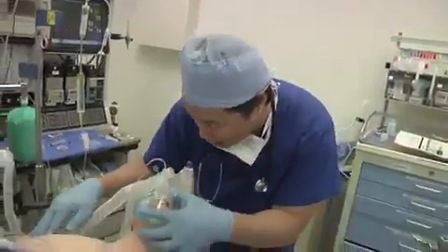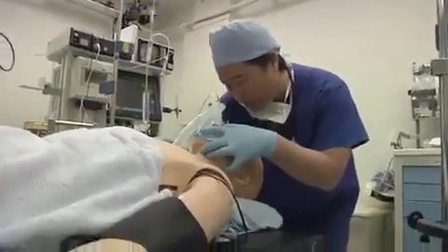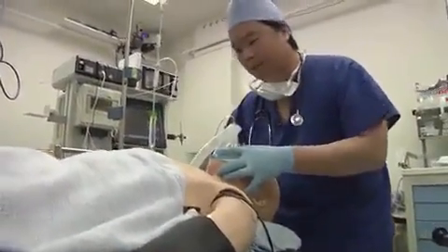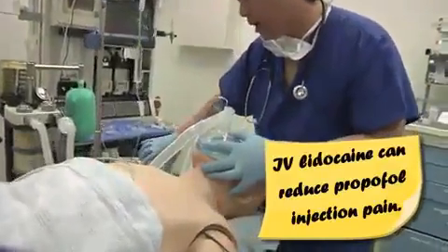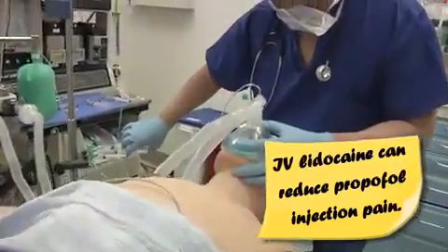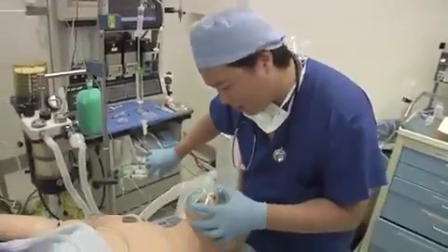Mr. Johnson? Yeah. I'm going to go ahead and give you some medicine to get you off to sleep now, okay? Okay. Now, this medicine sometimes stings a little bit when it goes in your arm. That's normal. Don't worry about that, okay? Okay. I want you to pick out a nice dream. Everything's going to go great. We're going to see you when you wake up, okay?